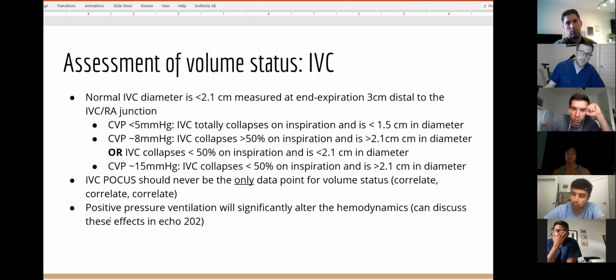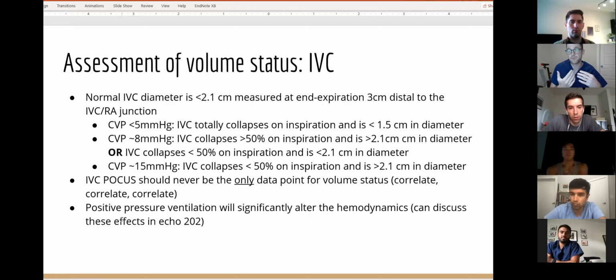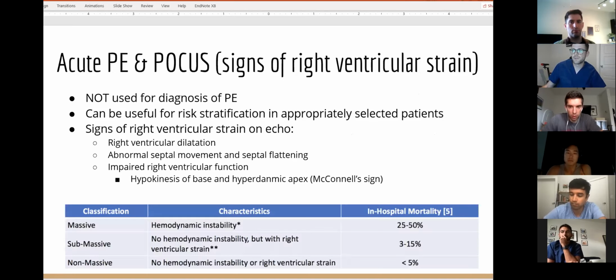And so the biggest studies were done on ventilated patients at 8 to 12 cc's per kg, paralyzed patients who are riding the vent. And if there was a distensibility, as opposed to collapsibility, of 15%, they were volume responsive. Some people will use that, but how many of your patients are meeting those parameters? Very few overall. So use IVC as more of a bimodal type picture.